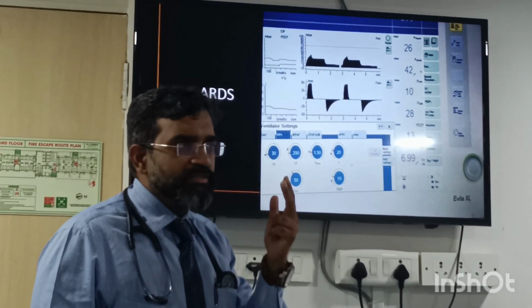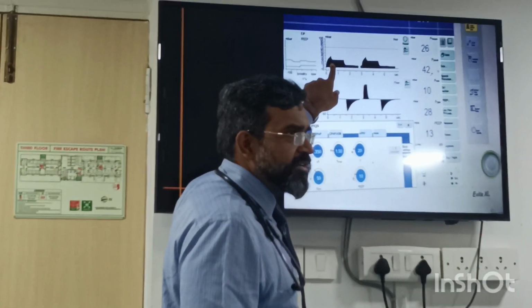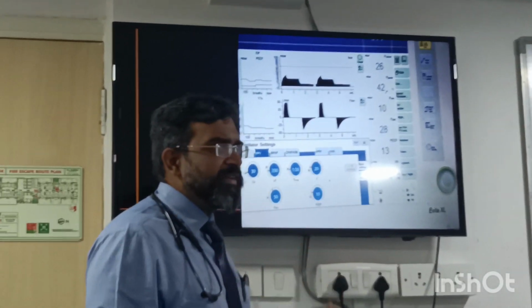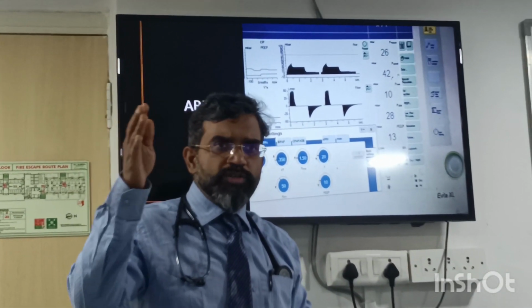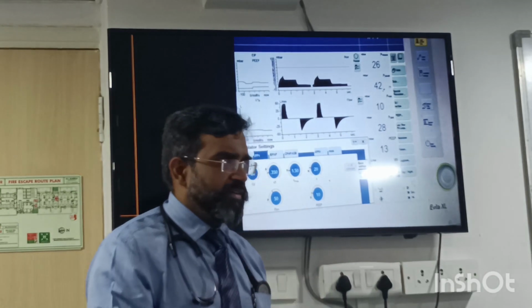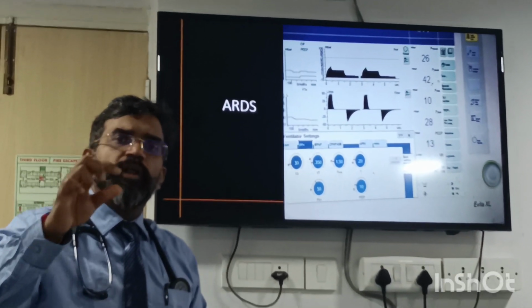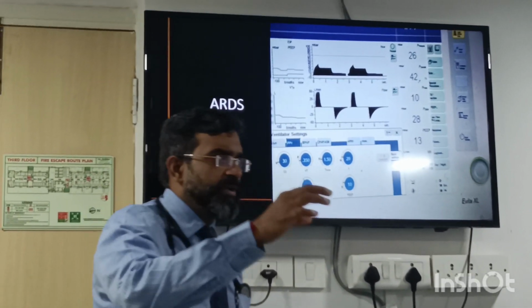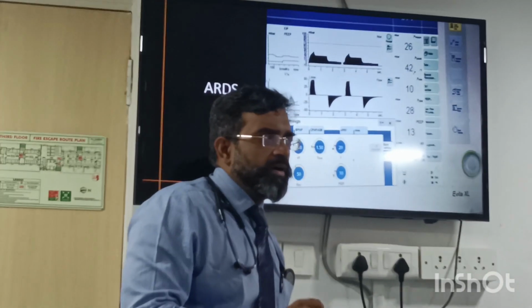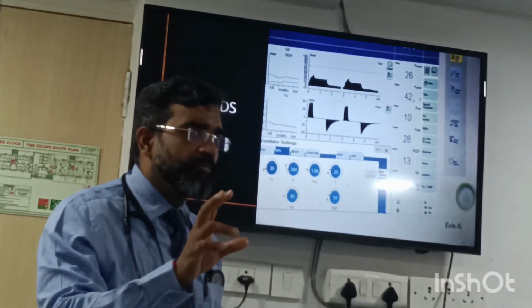So I will increase my inspiration, because my mean airway pressure is increased only in my inspiration. That is why when you go from 1:3 to 1:2 to 1:1 to 2:1, my oxygenation is improving. You understand? Because the positive pressure inside my airway is remaining high for a longer period of time. Clear? So these are the maneuvers that we are using to improve oxygenation.